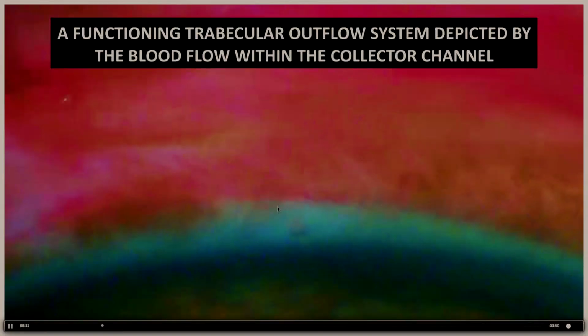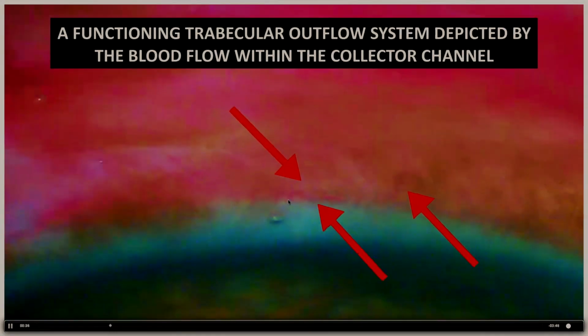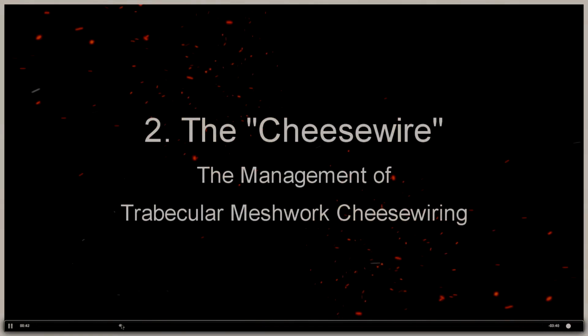Sometimes I have seen scenarios like this where, with the episcleral vessels, you can see that just adjacent to the stent, the perfusion actually starts. So you tend to have a fair share of learning curve.